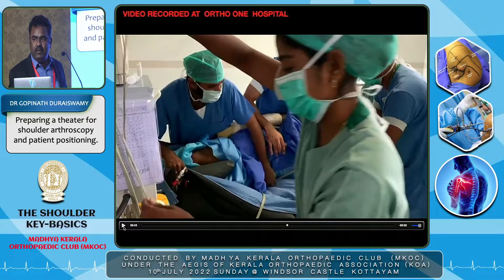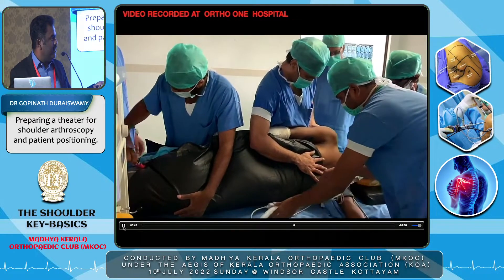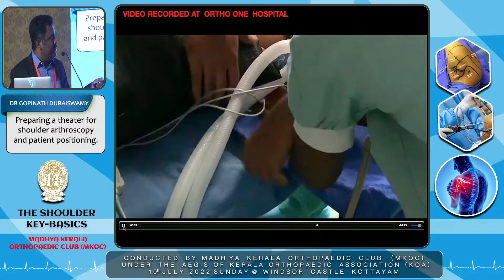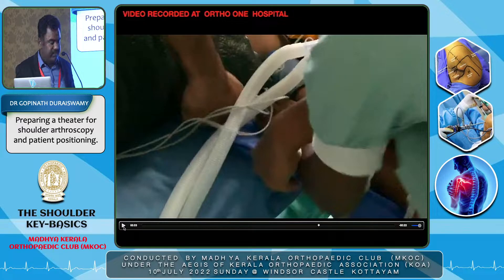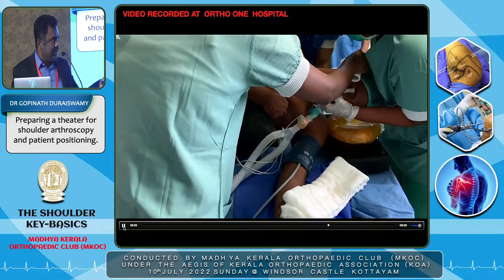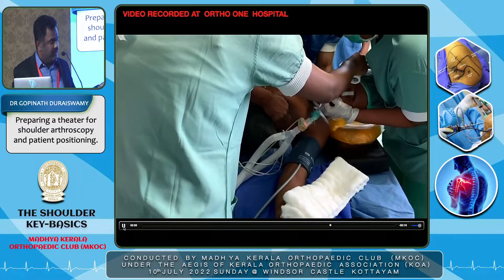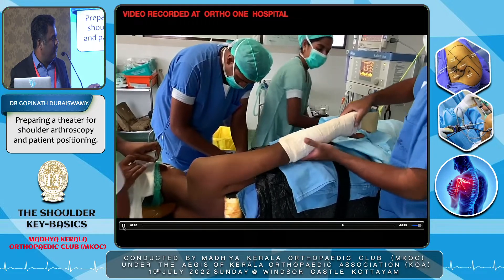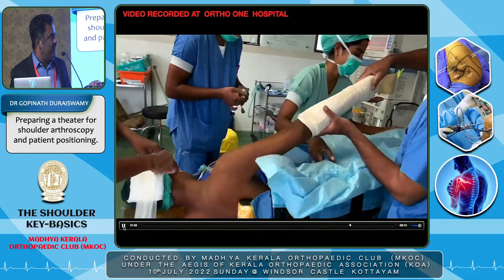Here you can see them wrapping the patient in a vacuum-assisted bean bag. Instead of posterior and anterior support bolsters, this bean bag is wrapped around the patient and once vacuum is applied, it forms a firm device holding the patient in the lateral position. The neck is protected with a gel foam pad and the axillary roll is positioned. This is optional equipment you can purchase if budget allows.